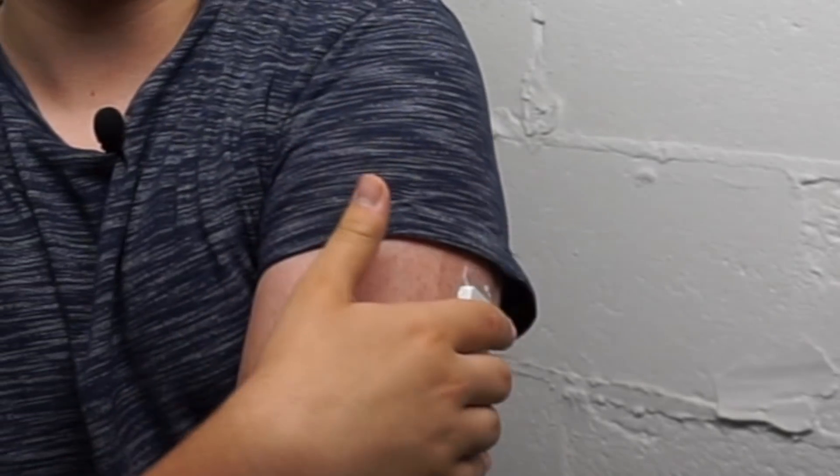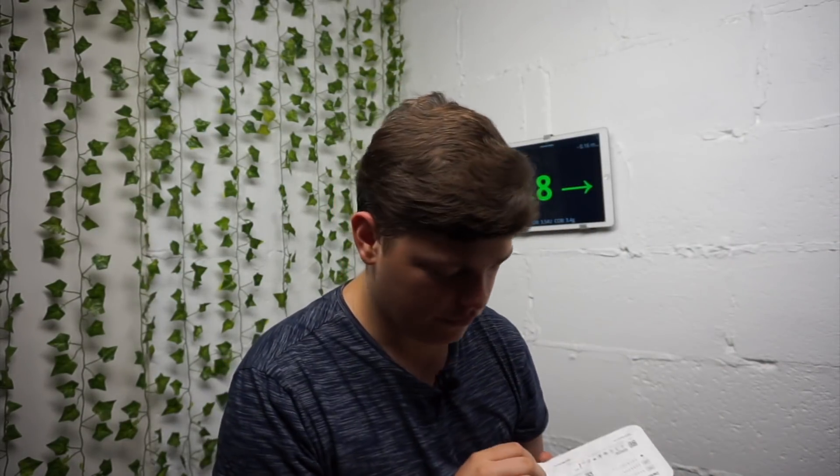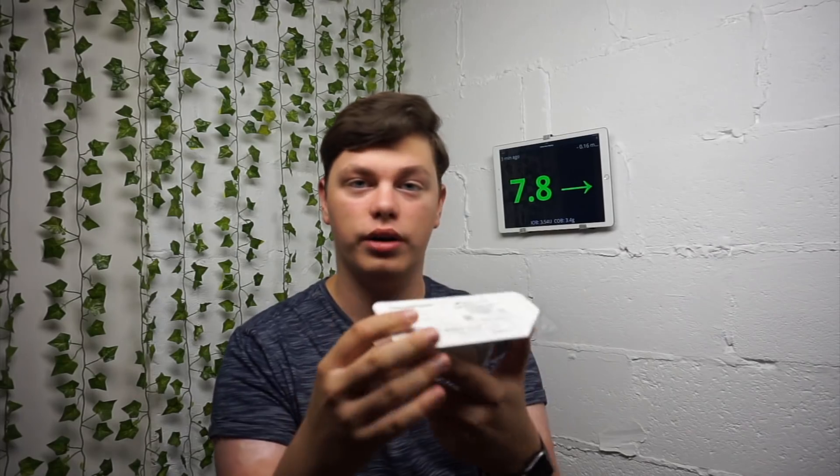I'll be comparing them to see which one is more accurate and which one I prefer — I'll make a video about it as well. After that initial week I'll probably make a decision if I want to stay on G6 full-time or just continue with my current setup. Okay, so let's get the first sensor. With the Dexcom G6 application it's easier than the G5 because it's like one click.